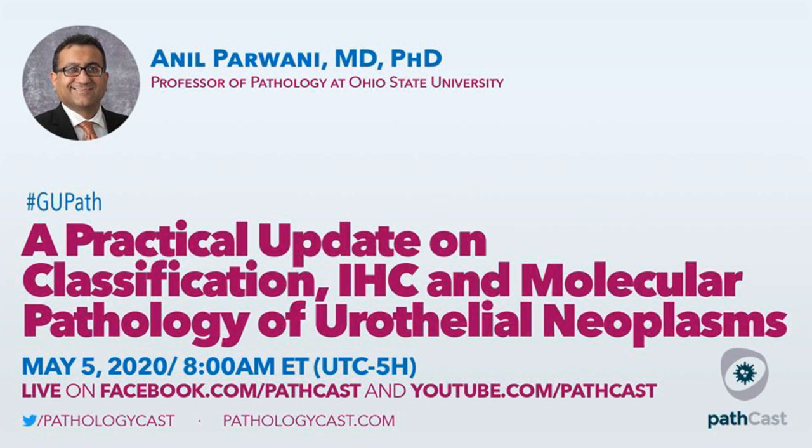If I have a resident with me, he or she will preview the cystoscopy report and look for what they saw on cystoscopy, because you can have a bland papillary inverted growth pattern within a bladder lesion which looks very bland. But if the cystoscopy report suggested a papillary tumor, which is exophytic, I will do a deeper section. I will look for any evidence of a papillary tumor.